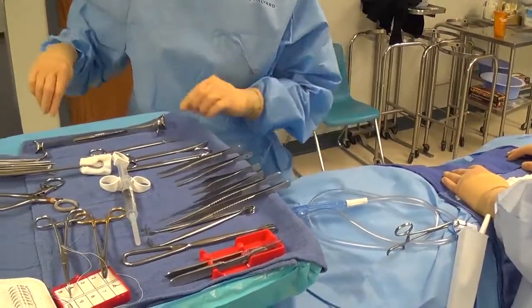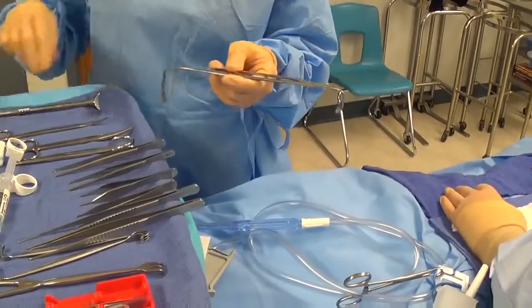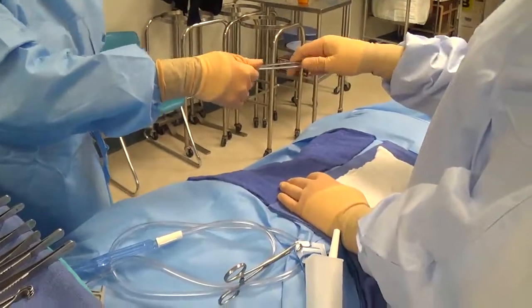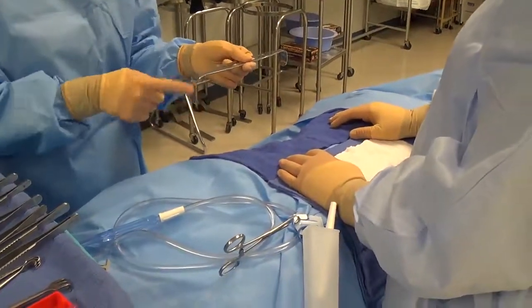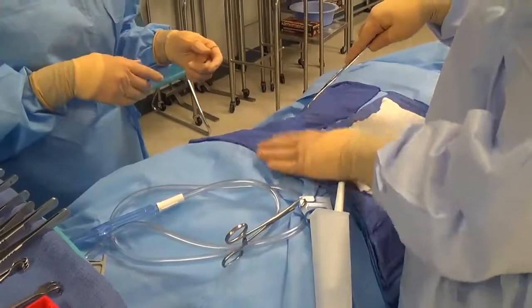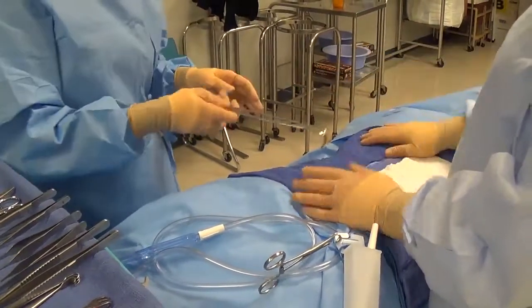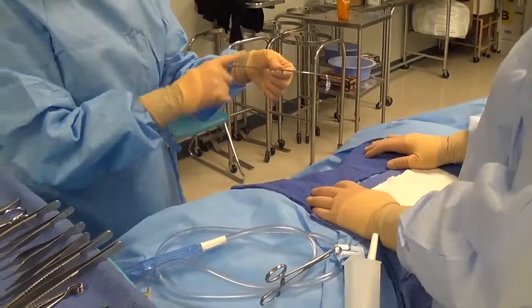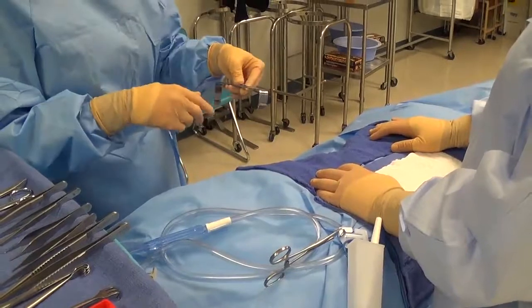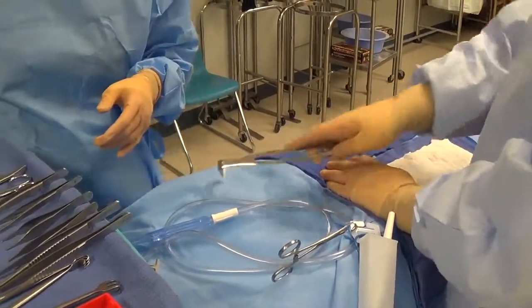For retractors without a sharp edge, such as the Army-Navy, you can hold on to the blade and hand it up to wherever the surgeon positions their hand. Never hand a retractor incorrectly — that's not to function and the surgeon will have to reposition it. It can be handed either direction depending on which blade will be used, which you determine by looking at the depth of the field and anticipating what depth of retraction the surgeon will need.